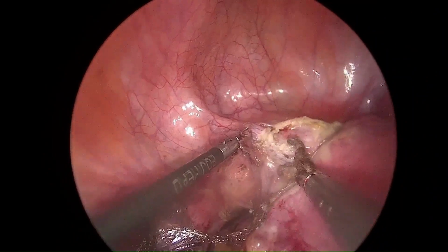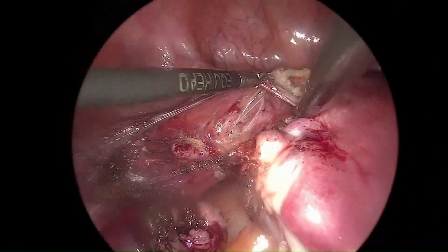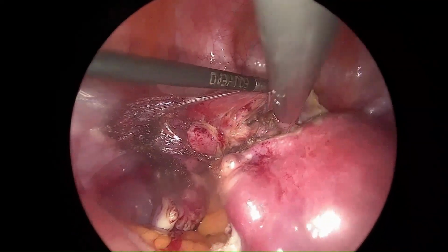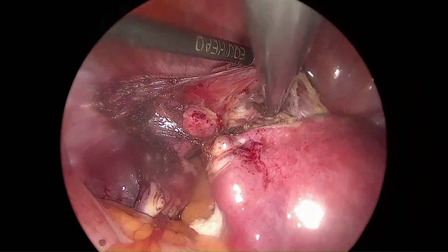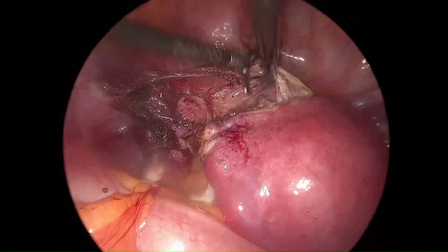In this soft and supple, unscarred area, we have to create a lateral window, for which we have to lift the bladder flap upwards, insinuate the prongs of the bipolar shearer underneath, medial to the uterine artery, and separate the prongs in such a way that a small window is created.